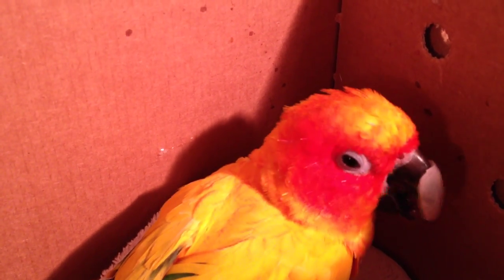This guy actually had his lower beak deviate to the left. We ended up having to trim this guy several times over the last several years. So Mom had seen the video of the other bird where we fixed the prognathism and decided that this was going to fix her bird.